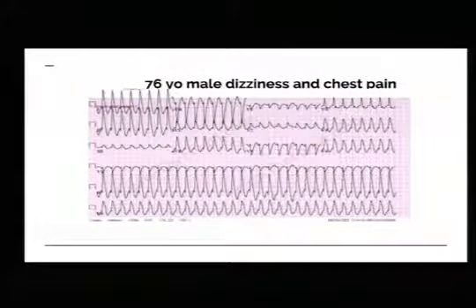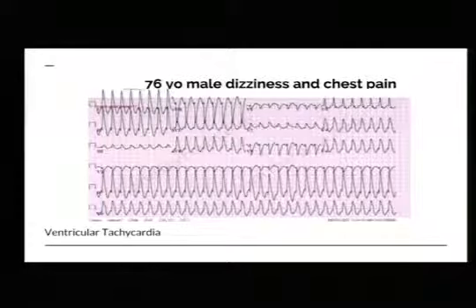Their stroke is diagnostic. So, 76-year-old male with chest pain. Dizziness and chest pain. What's this one look like? Yep. So this is your classic VTAC. It's regular. It's wide. So what are you going to do? They're talking to you. They're sitting there saying, I just don't feel so great. What are you going to give? What might you try?